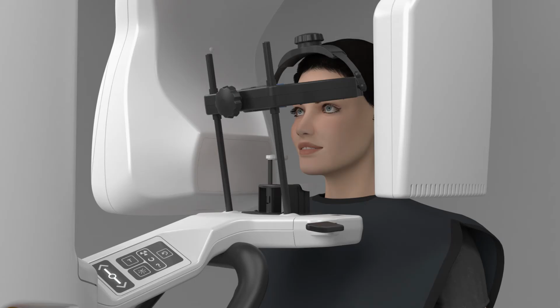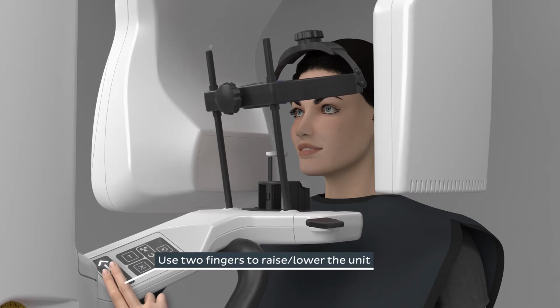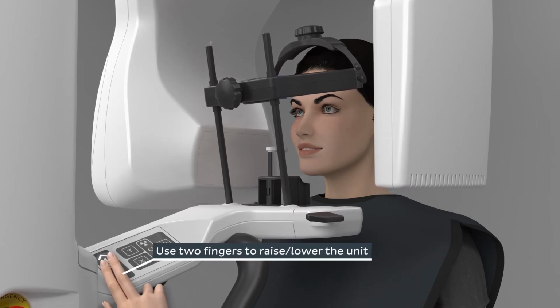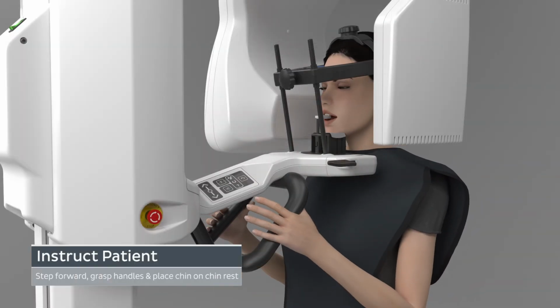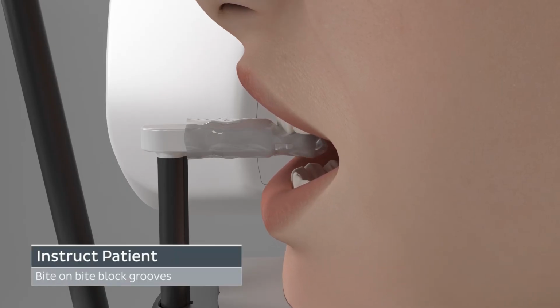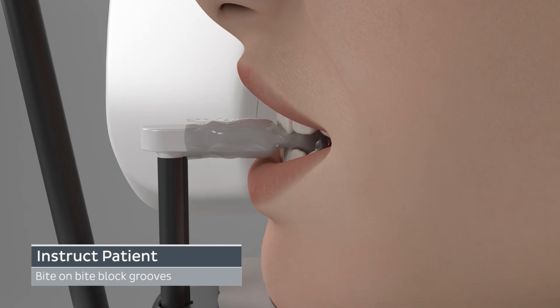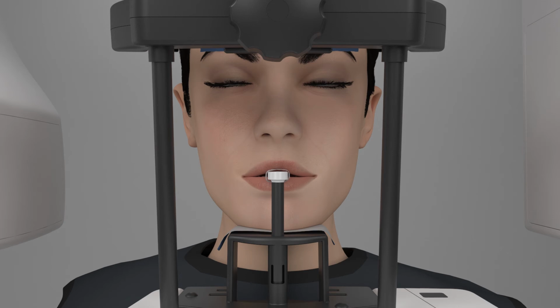Have the patient stand in front of the unit. Instruct the patient to stand as straight and tall as possible. With the patient standing outside of the unit, raise or lower as needed so the patient's chin is level with the chin rest. Have the patient step forward, asking them to grasp the patient handles and place their chin onto the chin rest and bite on the bite block so that both the upper and lower anterior teeth are in the bite block's grooves. Tell the patient to close their eyes so you can use the alignment lights to properly position them.